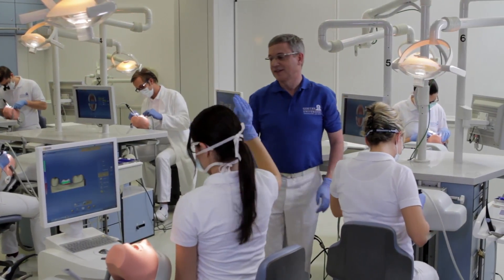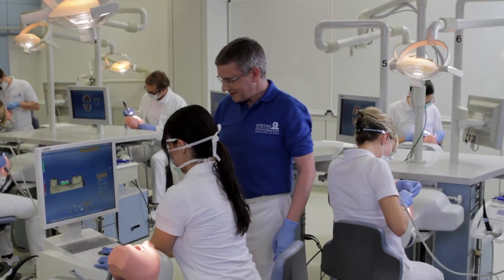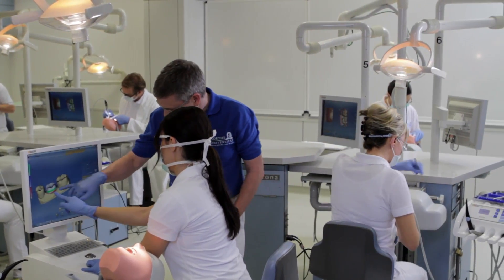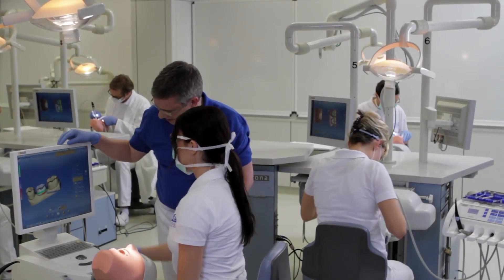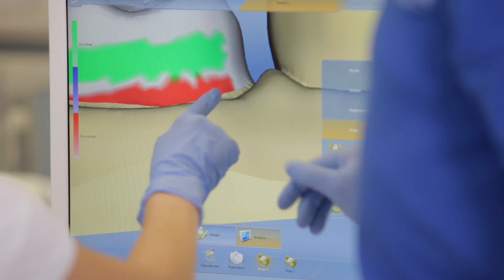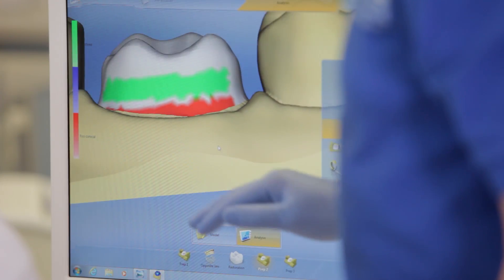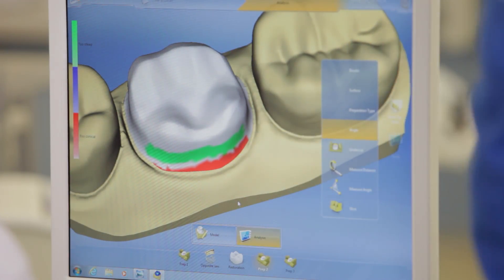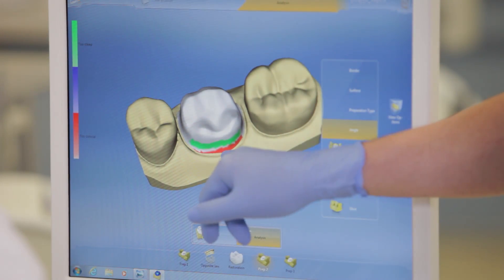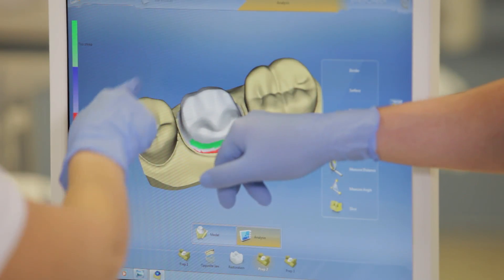Thanks to the mobility of CEREC AC, PrepCheck can easily be switched from one workplace to another. The analytical functions are easy to understand and allow for fast and objective assessment of working results. PrepCheck's documenting ability allows us to access all preparation analyses and results at any time, meaning that all evaluations can also be reliably reproduced at a later stage.